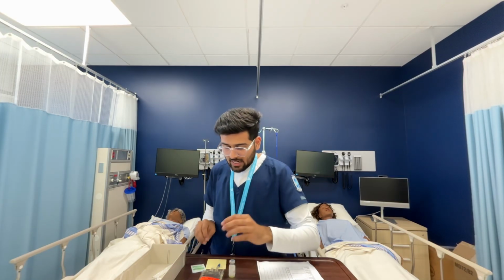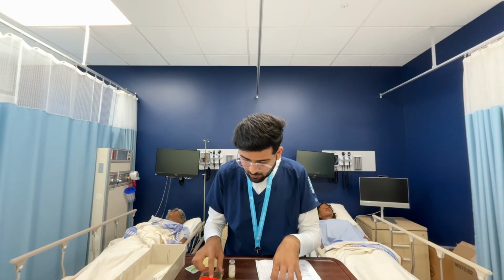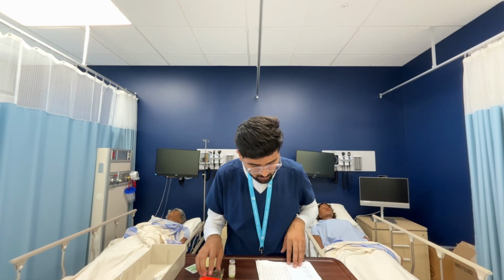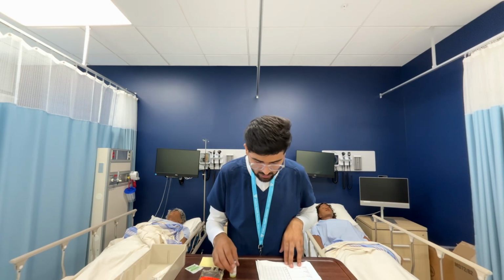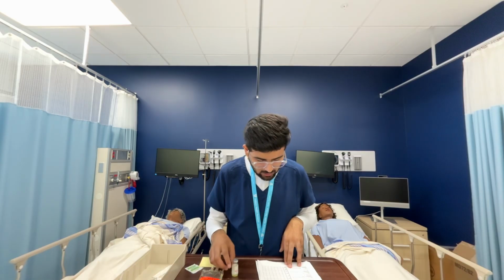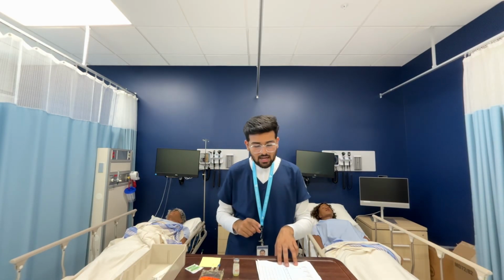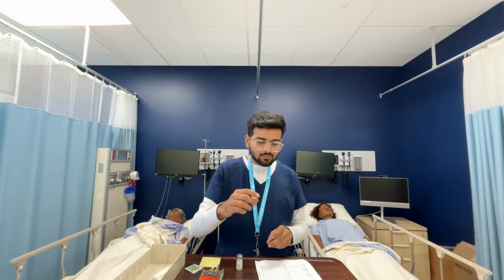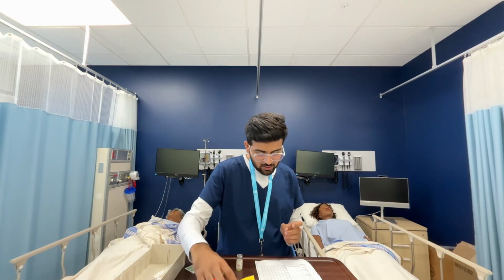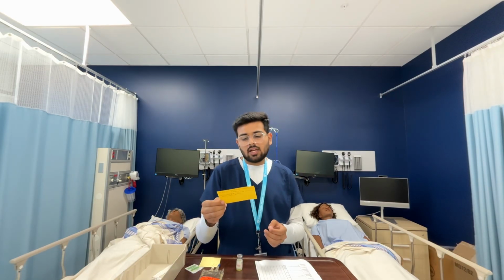Now I will start with my second check. Fiona Sherrick, right patient. Pantoprazole, right medication. I'm giving 80 mg, right dose. I'm giving through IV, right route. I'm giving twice a day, right frequency. I'm giving at 1000 hours, right time, and I'm giving because my patient is diagnosed with sepsis, and this medication helps prevent stress ulcer and GI bleeding. So I have a right reason over there.